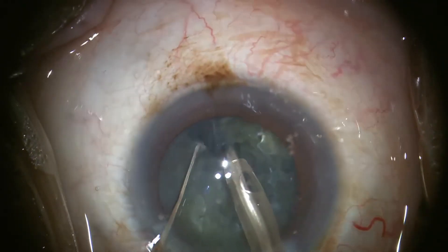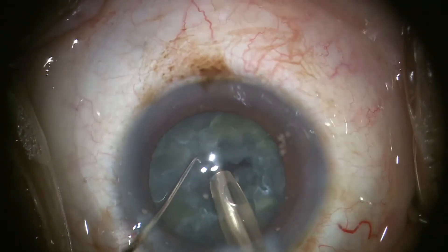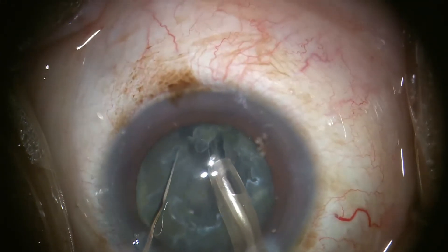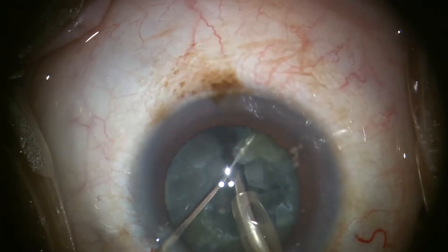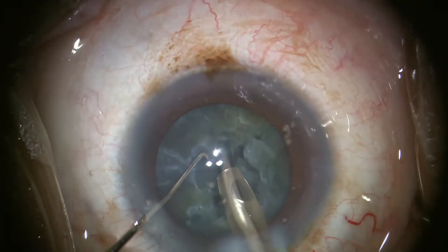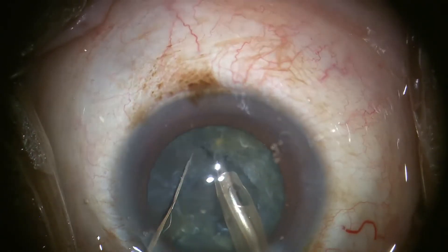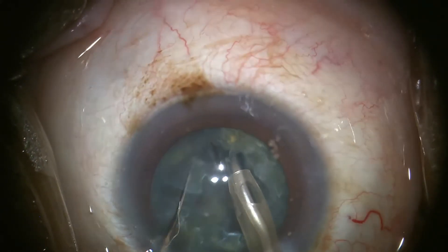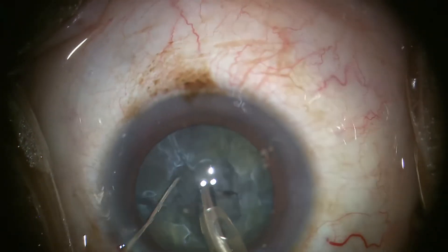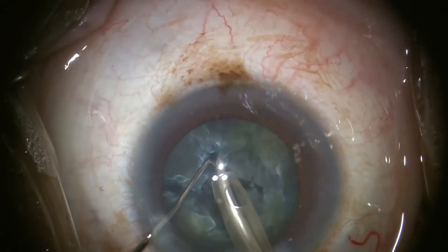A Szynski hook is placed on top of the lens, just peripheral to the FACO tip, before it is pushed down in a vertical chop motion, and then moved off to the left, propagating the crack that was started by the chop. The denser the lens, the more important it is to place the Szynski hook in line with the FACO tip to avoid rotating the lens around the FACO tip. This particular lens is divided into five pieces, but removal of denser lenses benefits from creating more petals, often as many as eight.